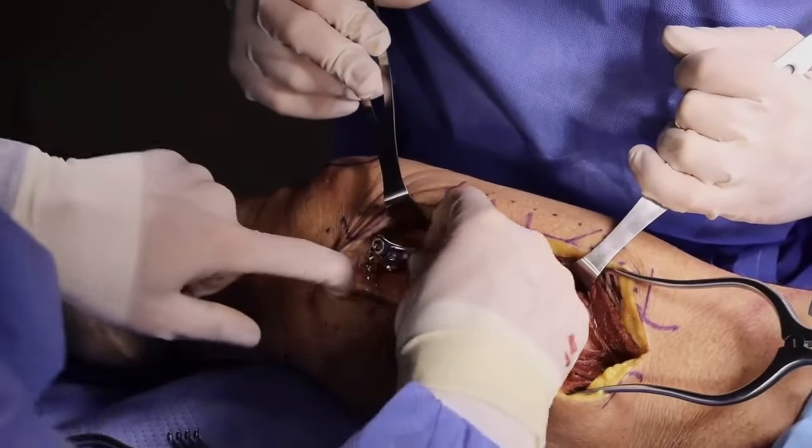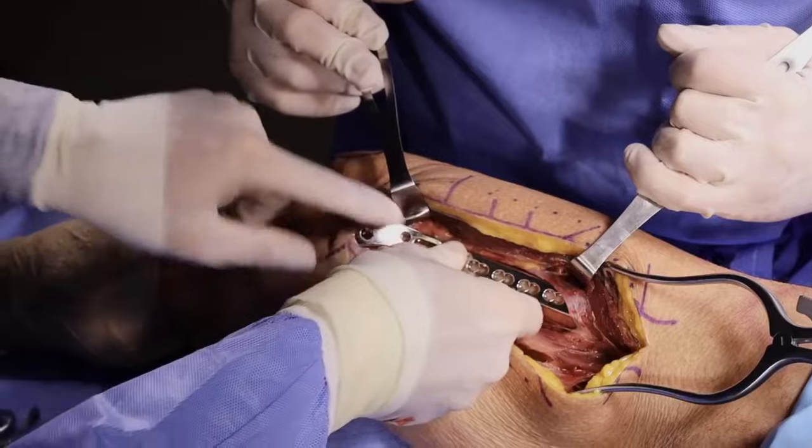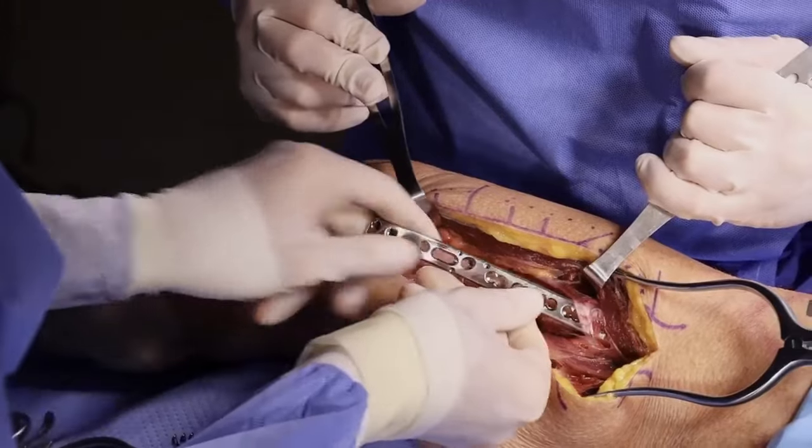It is rare to have a plate this high on the medial side, and thus this artery is typically not seen. However, in cases where the artery needs to be dissected, it can be safely found and protected while respecting the soft tissue envelope.